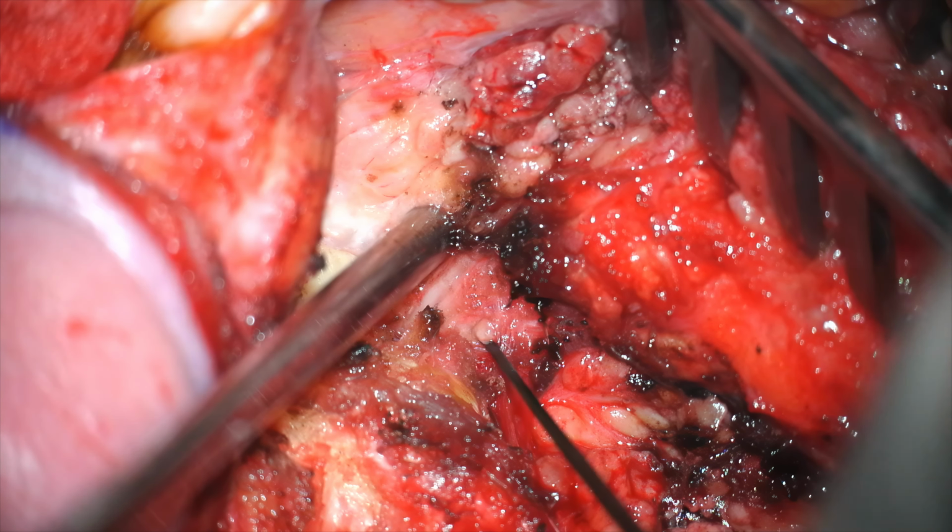Because that's right about halfway, in your mind, between the tragal pointer and the mastoid tip. It's right about there, and that's where it is. Between the tragal pointer and the mastoid tip, about halfway, and about a centimeter down. And that's what I did. I put the probe gently, about 1 centimeter, down right there, and that's where the nerve is. Okay?